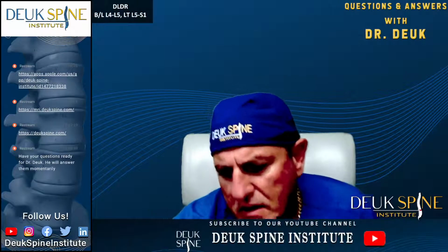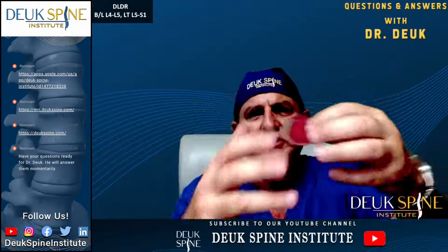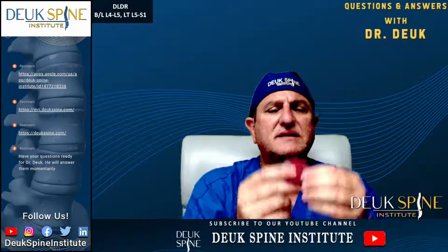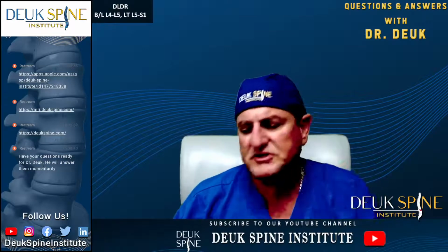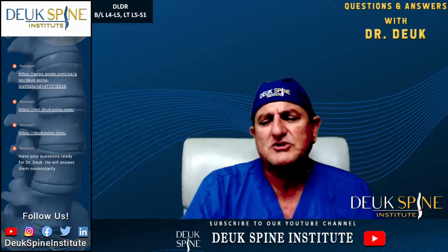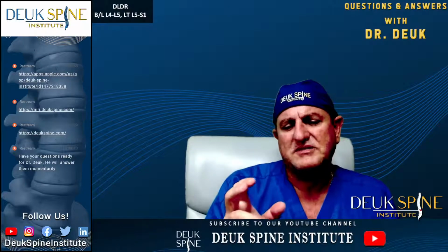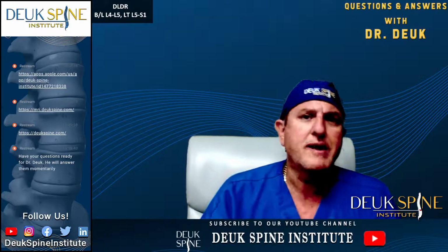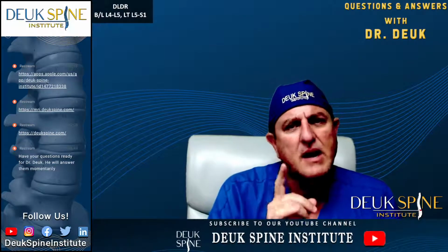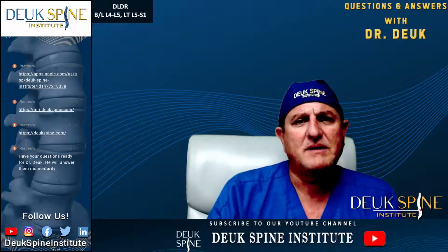There's a tear inside the back of the disc with jelly stuck in it. It can't heal. It's impossible. The only way to get it to heal is to clean out the jelly, clean out the tear, then it will heal. That's what the Deuk laser disc repair does. So my answer to you is therapy doesn't fix back or neck pain or thoracic pain from a herniated disc. It keeps you mobile so you don't deteriorate and get worse. It buys you time to allow the disc to cool off, start feeling better, and maybe give you some pain relief.